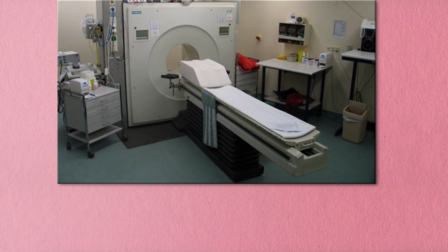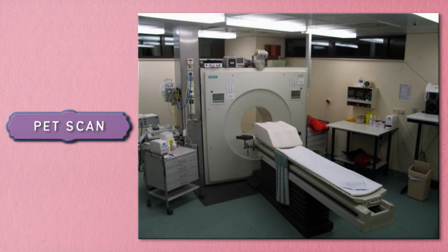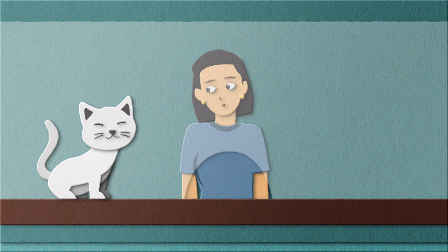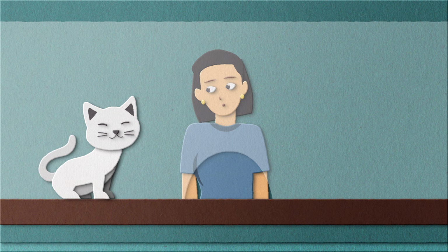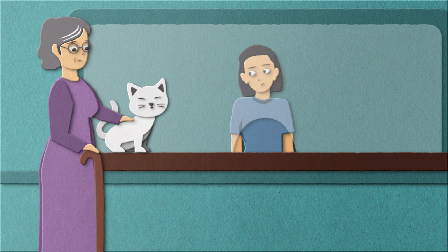The next medical imaging modality I want to talk about is PET. No, it does not involve using a cat or dog to diagnose something. PET stands for Positron Emission Tomography. And even though it's not as popular as the other medical imaging modalities, it is still a very important one. PET scan is often used in the diagnosis and monitoring of cancer and neurologic diseases like Alzheimer's.